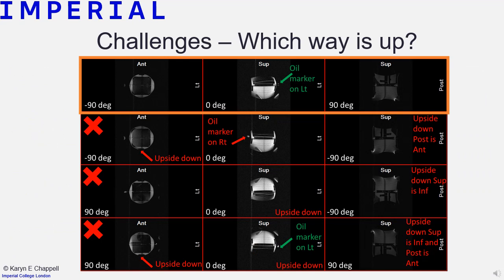We then had to check it all. That meant performing an experiment, scanning an object in every possible configuration until we found the ones that worked, so that the images matched the patient position exactly, even when we rotated, yawed and rolled the scanner around. We now use the default at the top for the lower limb, but the upper limb has a different set of values.